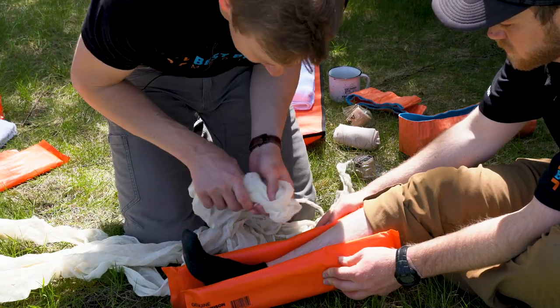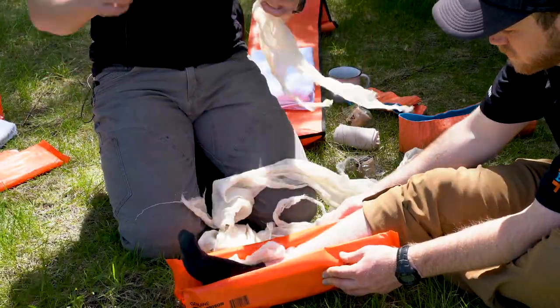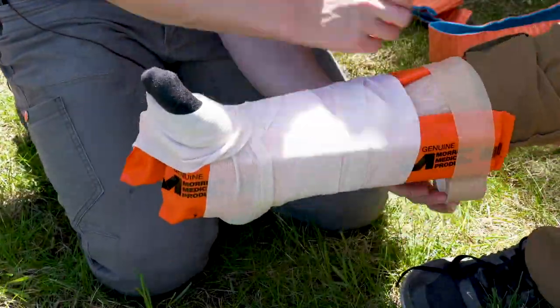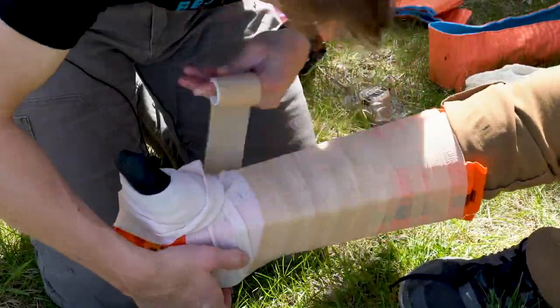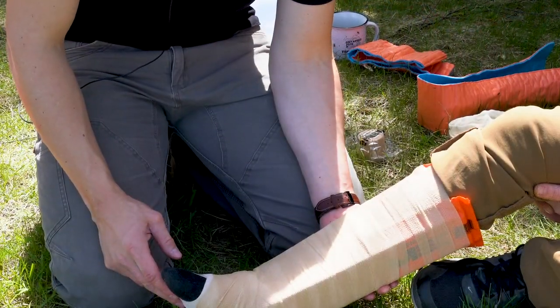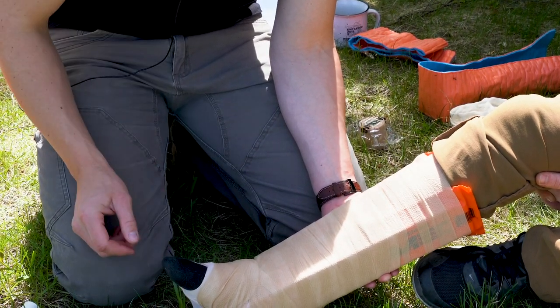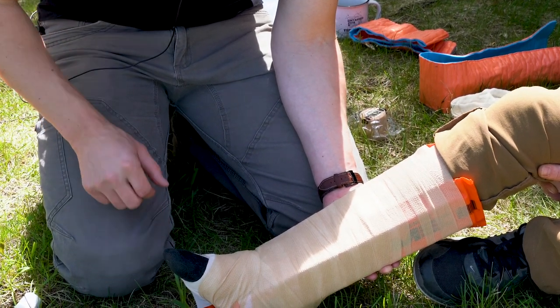It's important to pad any voids. After immobilization is complete, finish up by rechecking the patient's CSMs. What toe am I touching? Little toe. Can you wiggle them for me? Any numbness or tingling in there? No. And do a pinch. If you weren't wearing a sock, I could check your capillary refill.